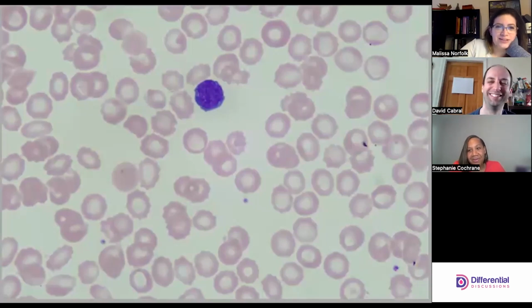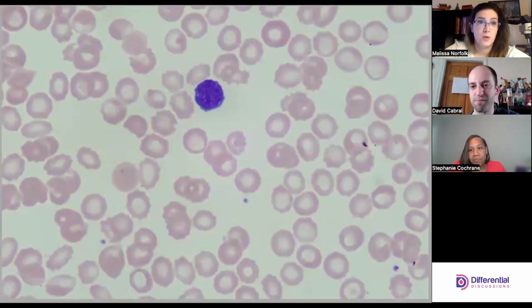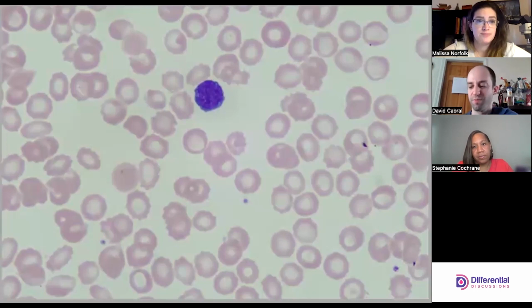Oh shoot, I thought I picked an easy one. I think the most challenging part was some of the neutrophils and our quote-unquote monocytes. A little bit weird. That was challenging. Everything else was kind of non-specific features. But I think having the non-specifics is good, because that's how a bunch of things are going to present, with non-specific morphologies. We'll definitely need some follow-up tests for this one.